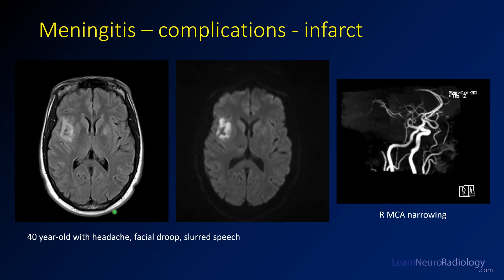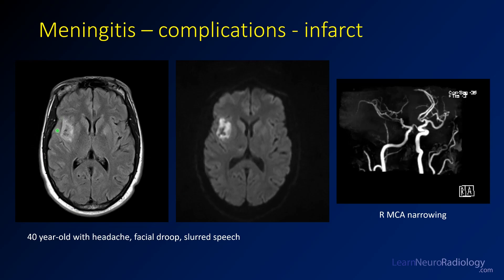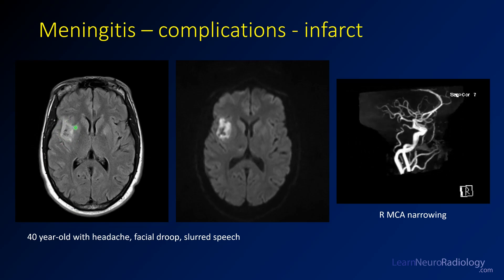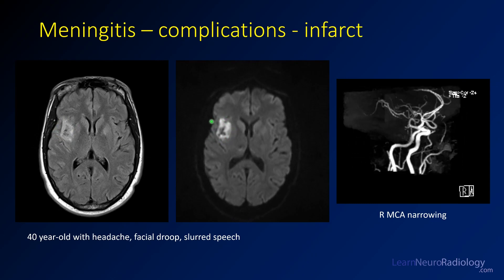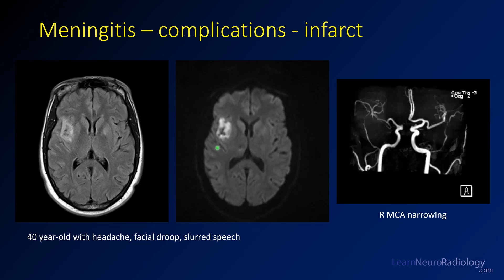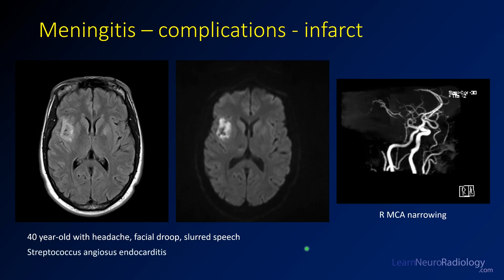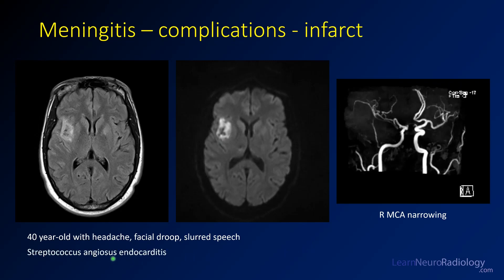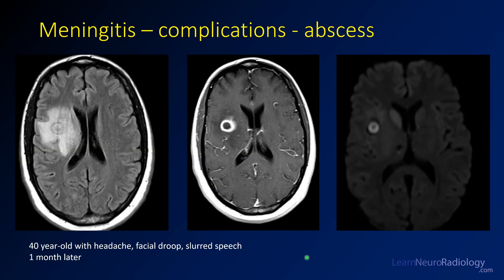Meningitis can produce complications. This example shows abnormal FLAIR in the insula and peri-insular white matter; on diffusion it is hyperintense, compatible with an infarct. On MRA, there is a paucity of vessels in the MCA distribution and areas of vascular narrowing due to irritation from material in the meninges. This patient had Streptococcus anginosus endocarditis with vascular occlusions in the setting of meningitis. One month later, a rim-enhancing collection developed with central diffusion hyperintensity — an abscess formed from septic emboli.